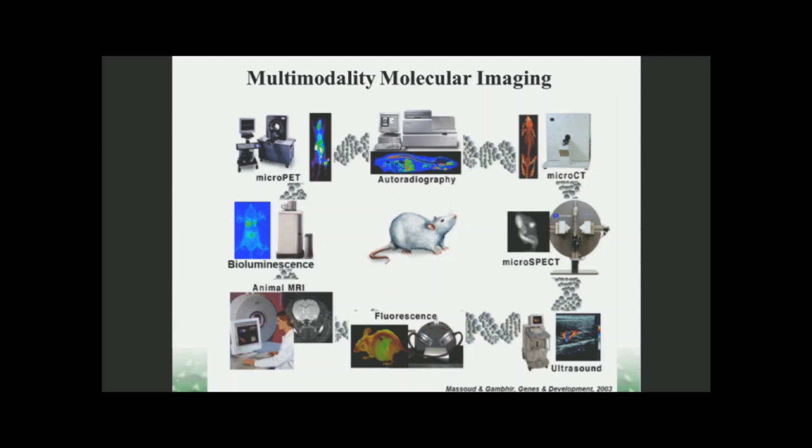But recently there are new trends. Those trends, to me, are more like a hybrid medical imaging. They take advantage of one component from a certain modality and then another component from another modality, and then put them together and come out with a new modality. Cerenkov Luminescence is a perfect example of that kind of approach.